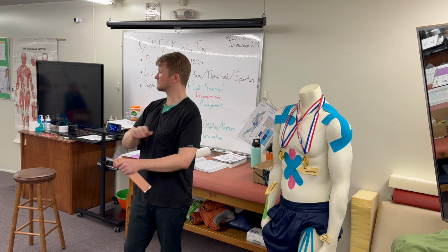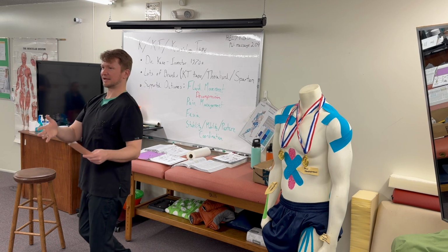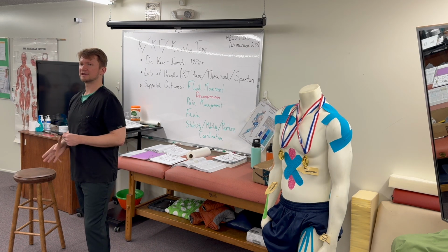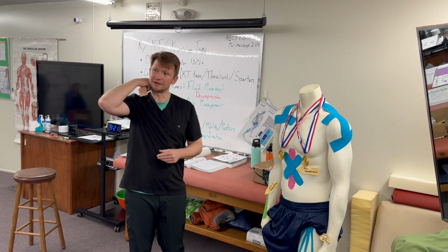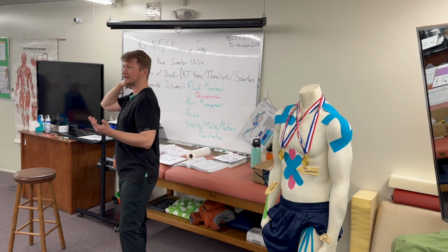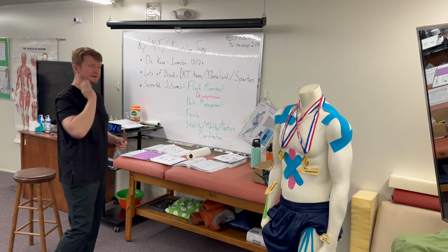You know, it could be just with a trimmer, it doesn't have to be the full shave kind of a thing. But that is an impediment, and it includes causing issues with taping closer to the back of the neck, coming up to the hairline. Ideally, yes, for headaches and stuff, I could take this tape and follow the anatomy all the way up to the base of the skull.